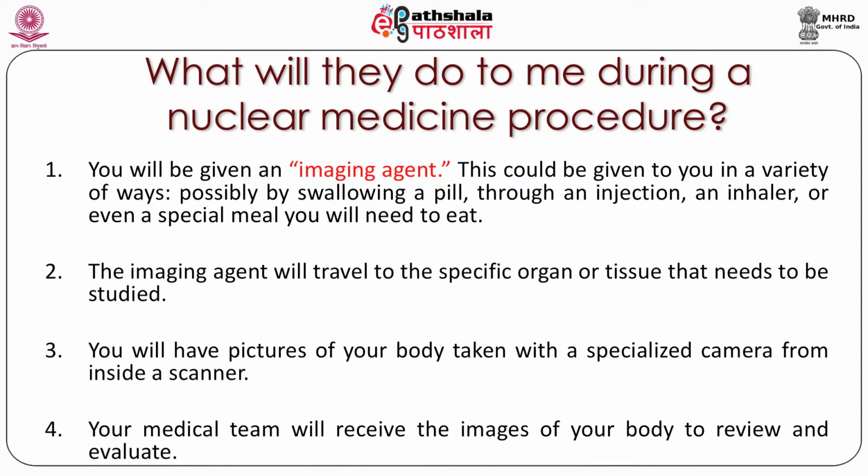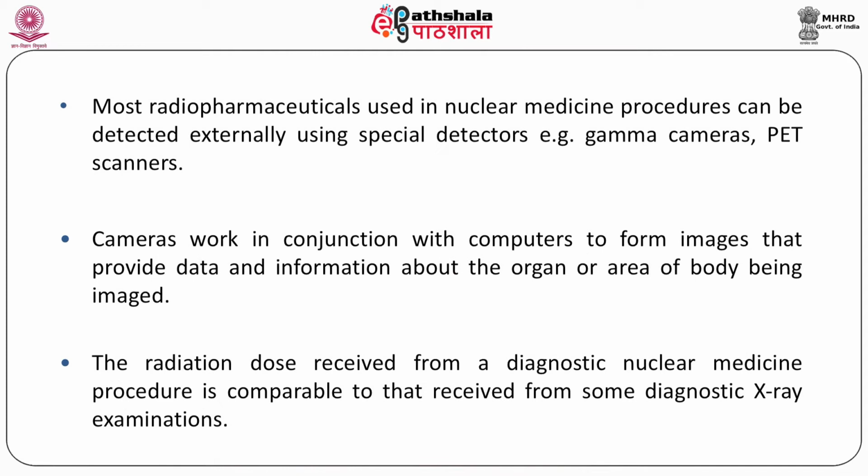When we take any kind of drug, here we don't call it a drug, we call it a radiopharmaceutical. It goes into the body by different mechanisms. Radiations are emitted from the organ which we want to diagnose, and after detection by these special devices, images are created, and these images are utilized by the doctors to design or formulate the treatment regime. Most radiopharmaceuticals used in nuclear medicine procedures can be detected externally using special detectors.